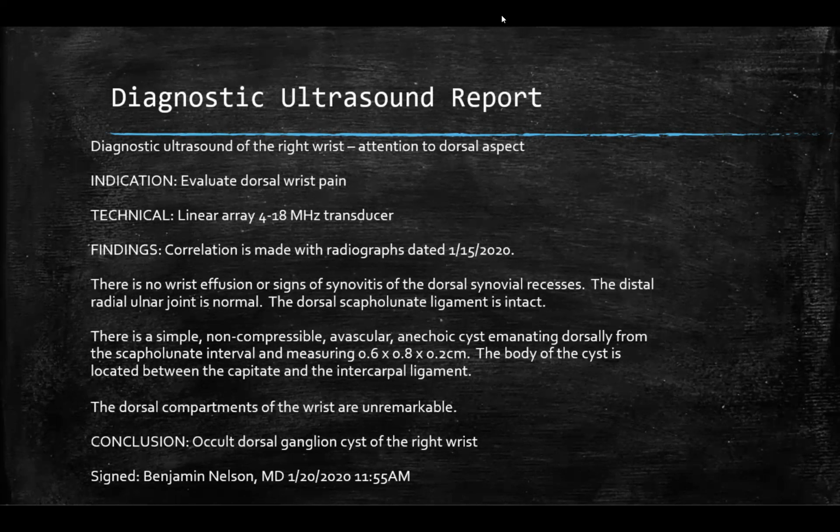I'll just make a couple comments. One is, there are many ways to do the report, and some people like to have templates for the report and fill in. In this case, Dr. Nelson chose a prose form, but there isn't just one way to do a report as long as all the information is in there and it's complete.